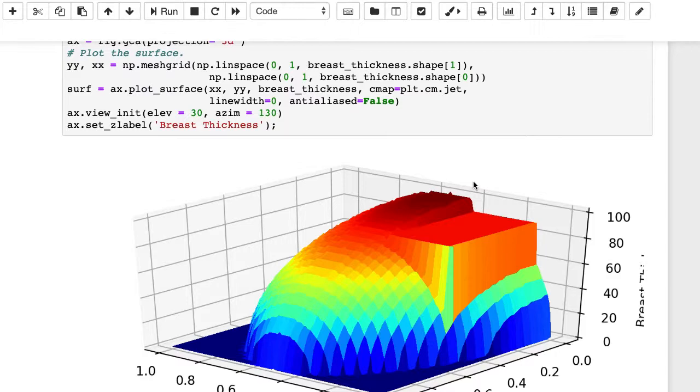And so we know that actually the breast isn't shaped like that. It doesn't have this square inside it. In fact, there's a region inside where the density is changed. But if we are just trying to take the images and reconstruct, we don't have the ability to separate what's actually coming from the changes in attenuation and what's coming from the changes in shape.